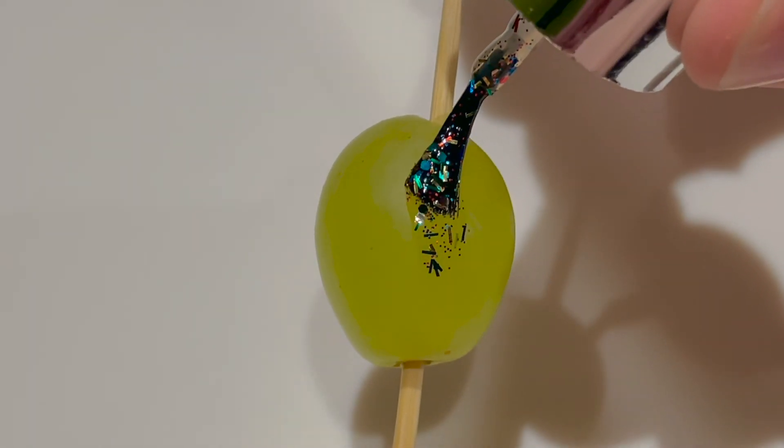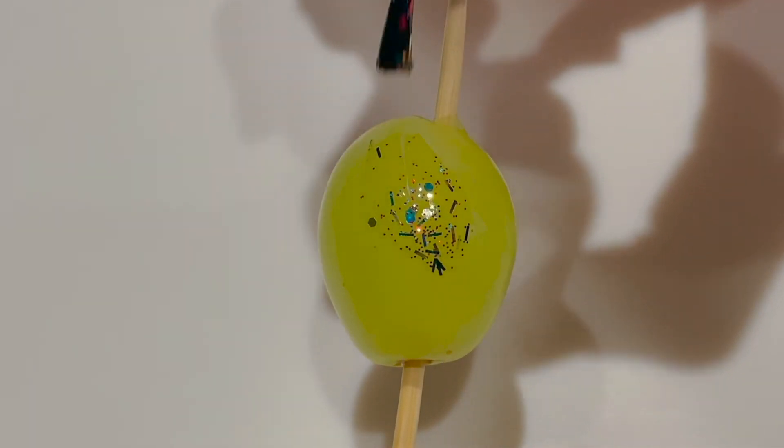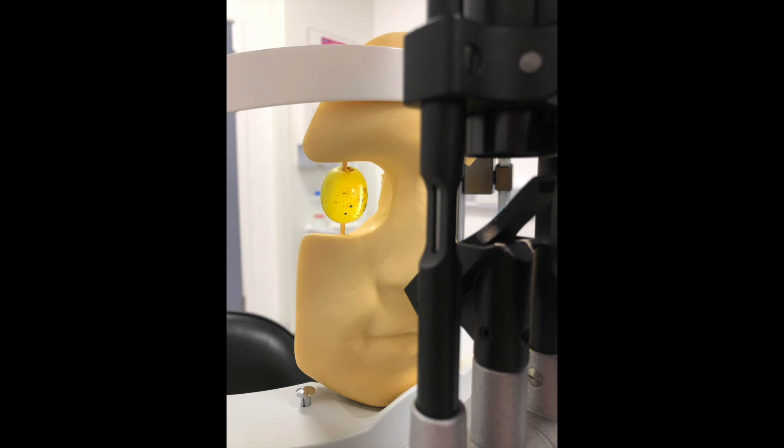To make a model for corneal foreign body removal, paint a grape with glitter nail varnish or glitter glue and allow it to dry. Mount it on the slit lamp, and if you can use a model head, this makes it more realistic. Use a 21-gauge green needle bent at the tip to lift off a superficial foreign body. Or use a burr to remove deeper rust rings by gently touching the surface of the cornea over the rust. Spending time practicing this first means it's much easier with a patient.